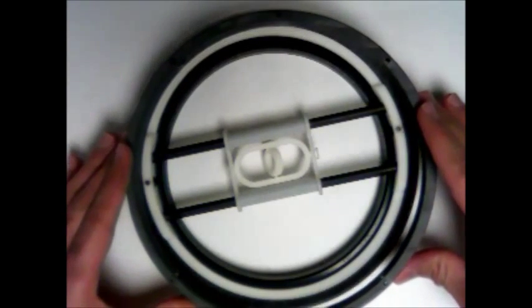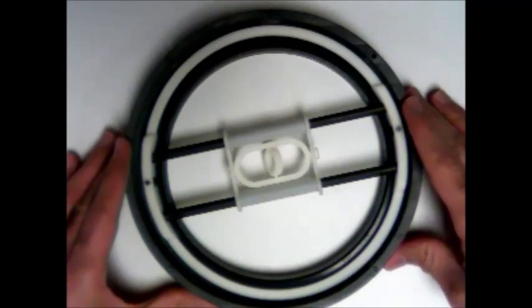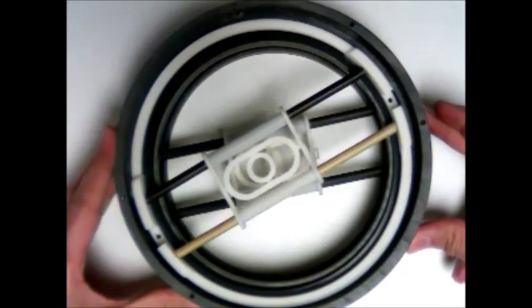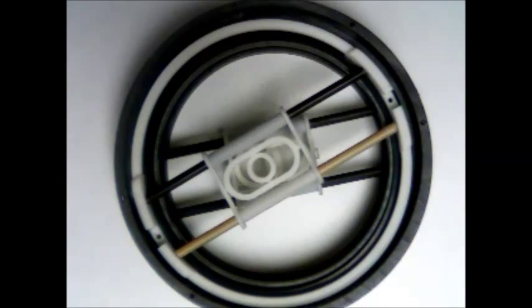An outer cylinder is attached to the casing and hence forms a base for the second level. The second level is exactly similar to the first one. Finally, the end effector passes through the universal joints.